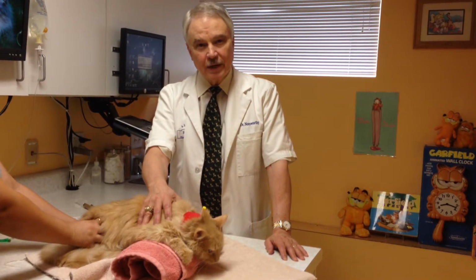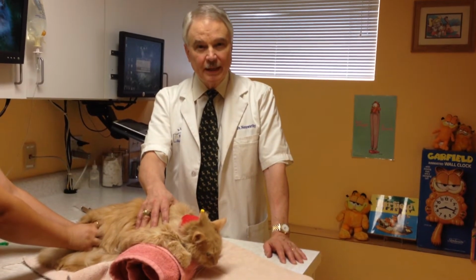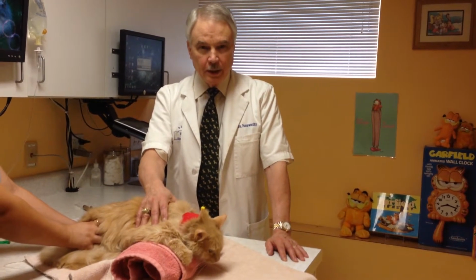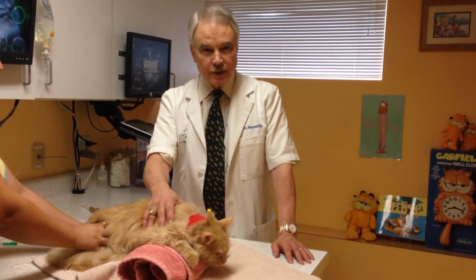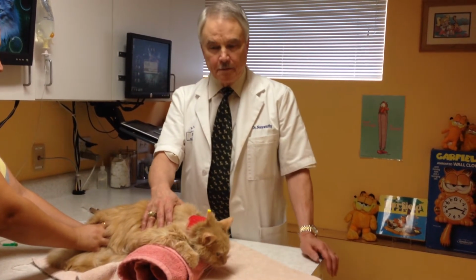We have put an esophagostomy tube in your cat. This tube allows you to feed the cat at home without being stressful to the cat at all. The feeding tube goes through a very small incision in the side of the neck. It goes into the esophagus, but it does not go all the way into the stomach.